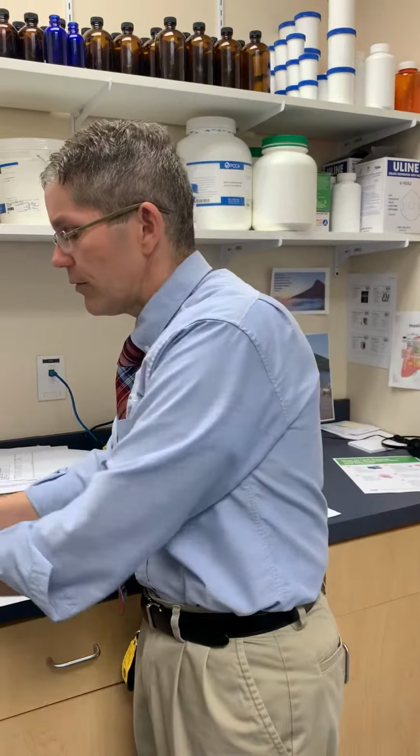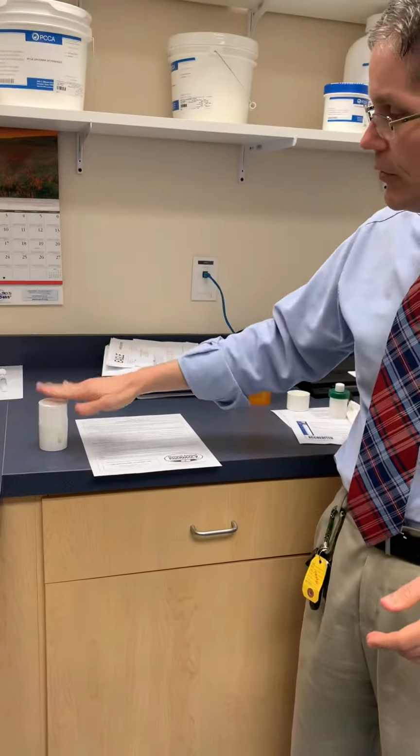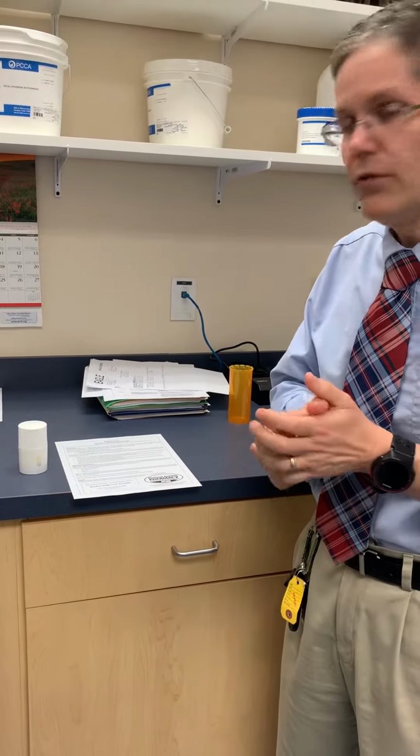Now for testosterone, men are going to often put that and rotate sites. Could be anywhere on the upper body. It's either going to be a 0.5 or 1 ml dose, typically once a day. Recap it so that the cream won't dry out. Again, as the window goes up, you'll see when you need some refills on that.